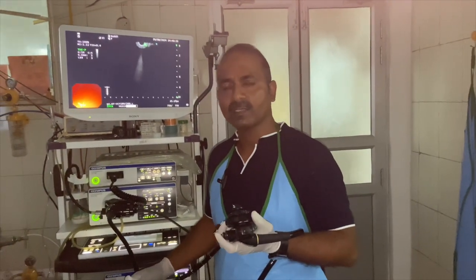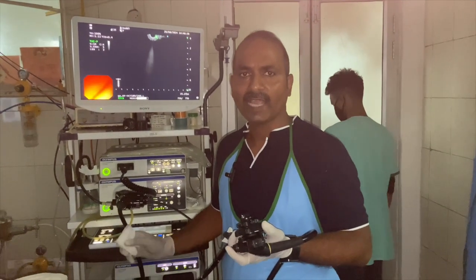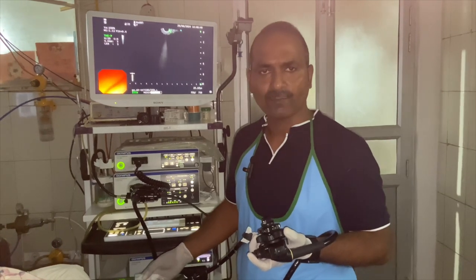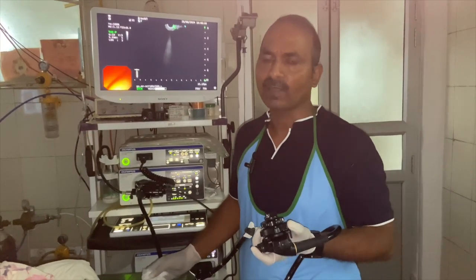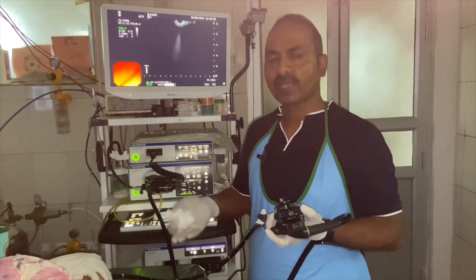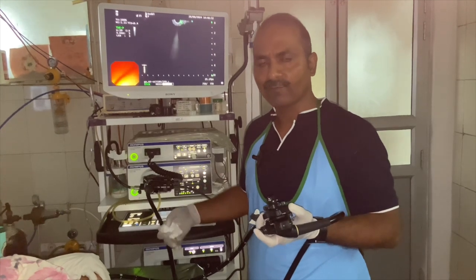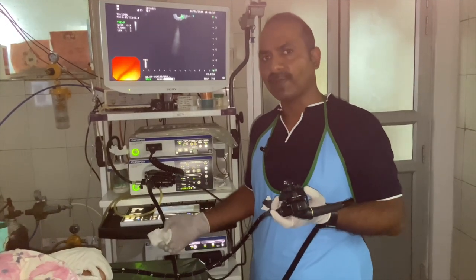We have examined the segments from the cardiac end, with the help of hepatic veins, and we have located the segment 1, segment 8, segment 7, with the landmark being the right hepatic vein. Then we have proceeded to the segment 1 again, segment 4A and segment 8, with the help of the landmark of ligamentum venosum and the middle hepatic vein.